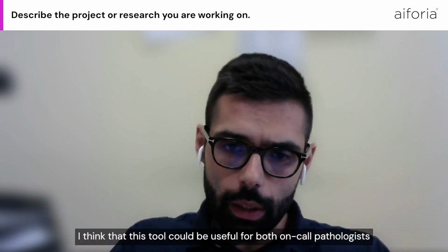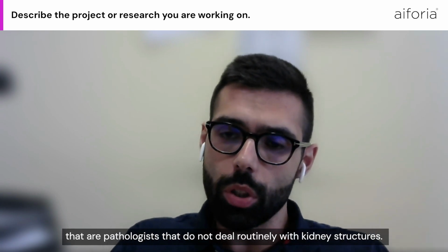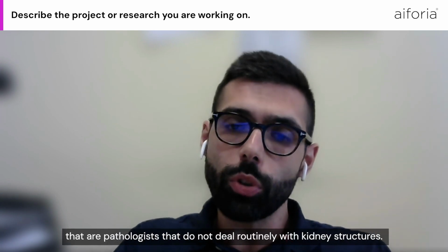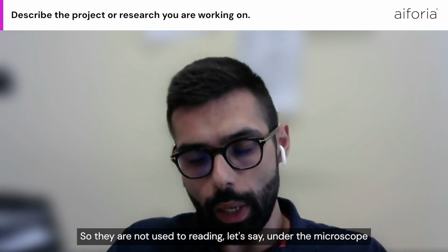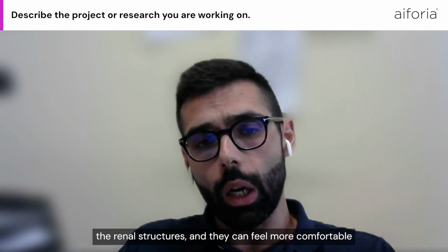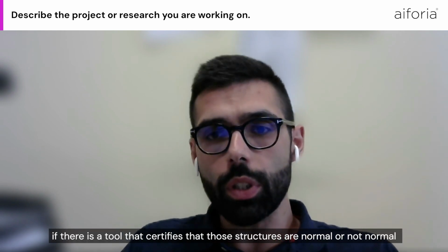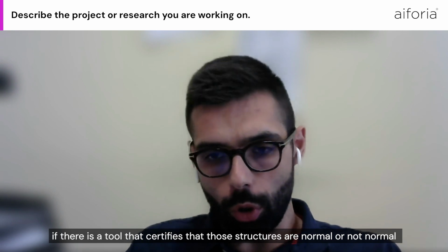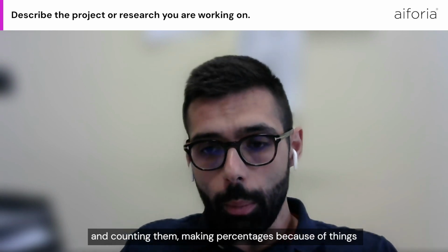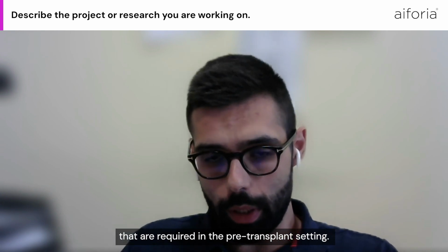I think that this tool could be useful for on-call pathologists, that is, pathologists that do not deal routinely with kidney structures, so they are not used to reading renal structures under the microscope, and they can feel more comfortable if there is a tool that certifies that those structures are normal or not normal, and counts them, making percentages, because those are things that are required in the pre-transplant setting.